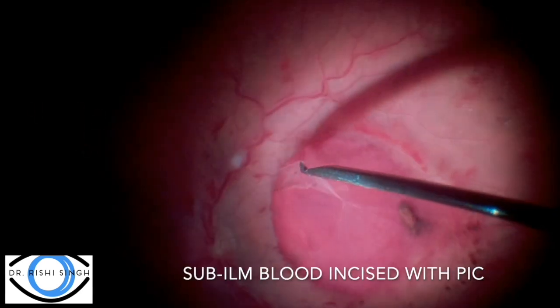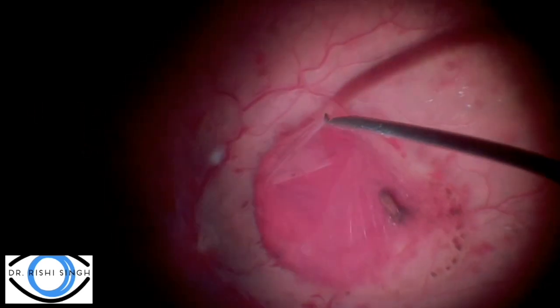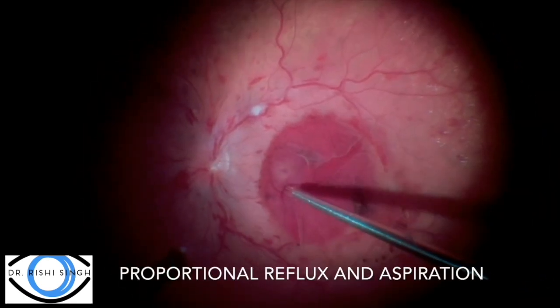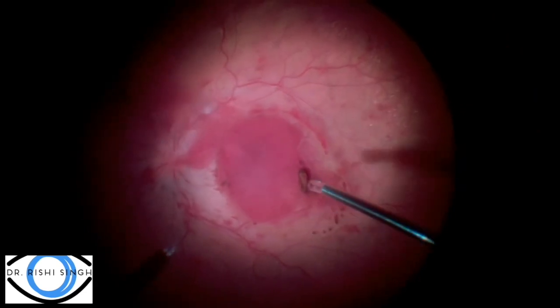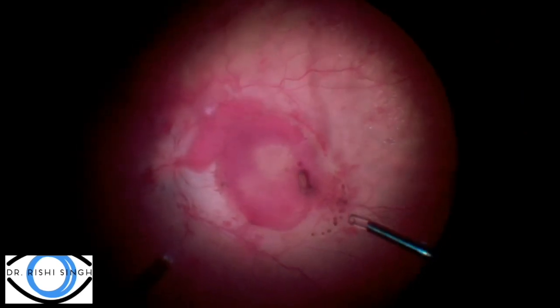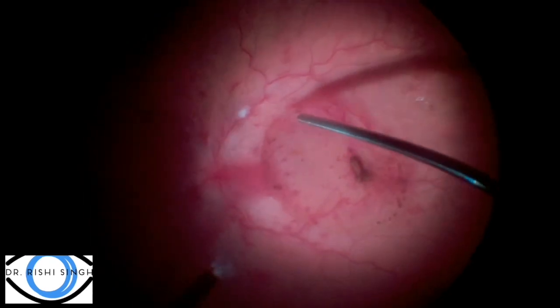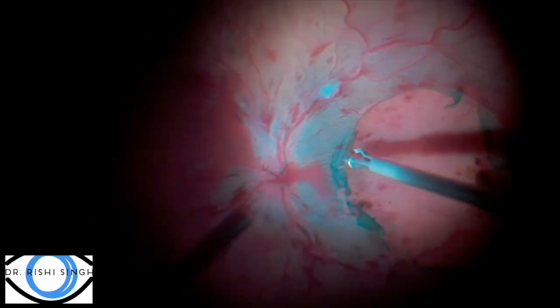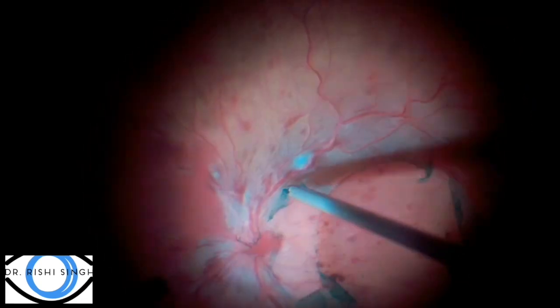In these cases we can use a pick to remove the internal limiting membrane tissue and access the sub-ILM blood. The surgeon then used a soft tip to remove the ILM tissue, and with proportional reflux he mobilized the hemorrhage and then performed the aspiration. ICG dye was used to stain the ILM tissue and to help widen the peeling with asymmetrical forceps.